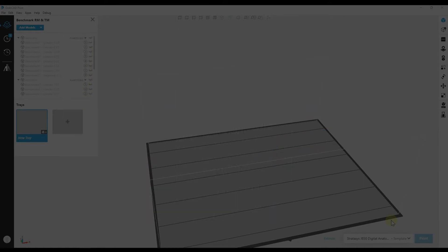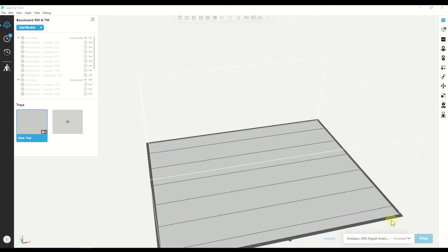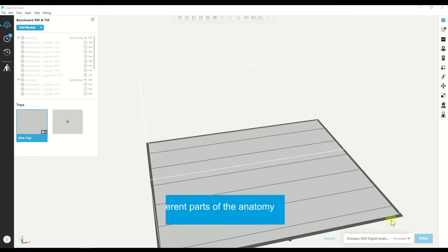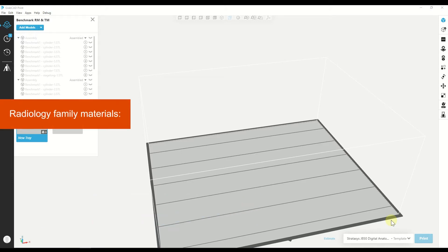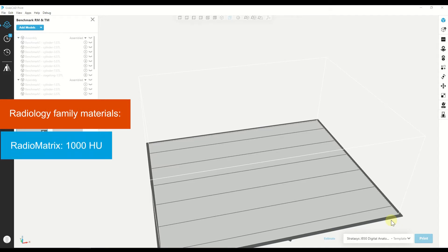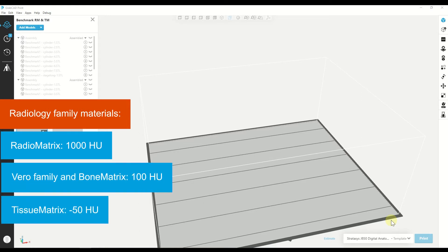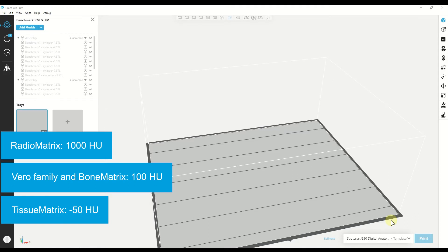Using the Radiomatrix mixed with different materials, we can have a large scale of Hounsfield values to mimic different anatomies. The materials that we have in the Radiology family are the Radiomatrix, which can reach up to 1000 Hounsfield value, the Vero family and bone matrix, which are around 100, and the tissue matrix, which is the lowest one, it gets to around minus 50.